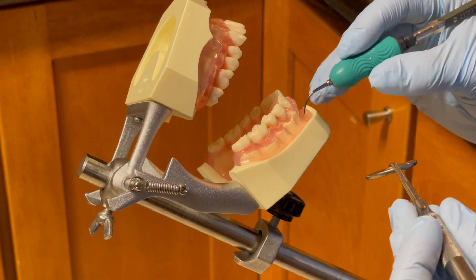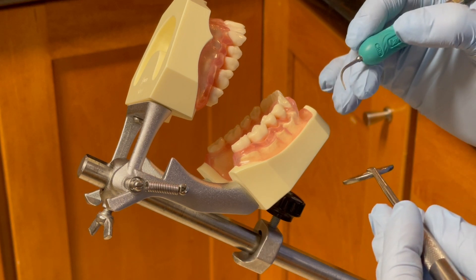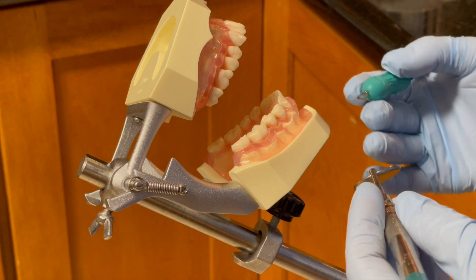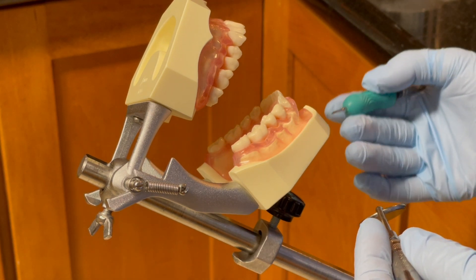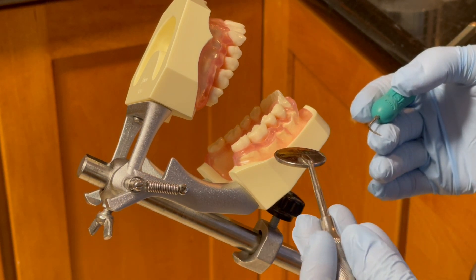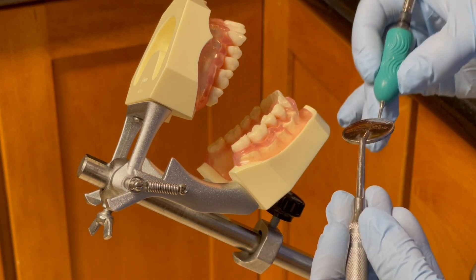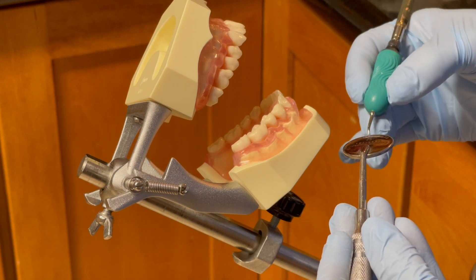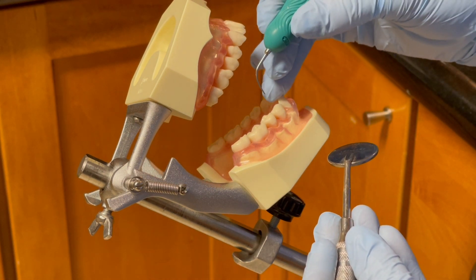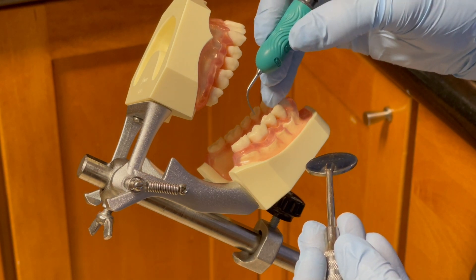For 29-30 buccal aspects, I will be sitting at 8 to 9 o'clock. The patient is in supine position with head tilted away from me. For the non-dominant hand, I will hold the mirror for indirect vision or retraction. For the dominant hand, I will hold the ultrasonic handpiece with a light modified pen grasp and establish a stable fulcrum on a few teeth away from the working tooth.